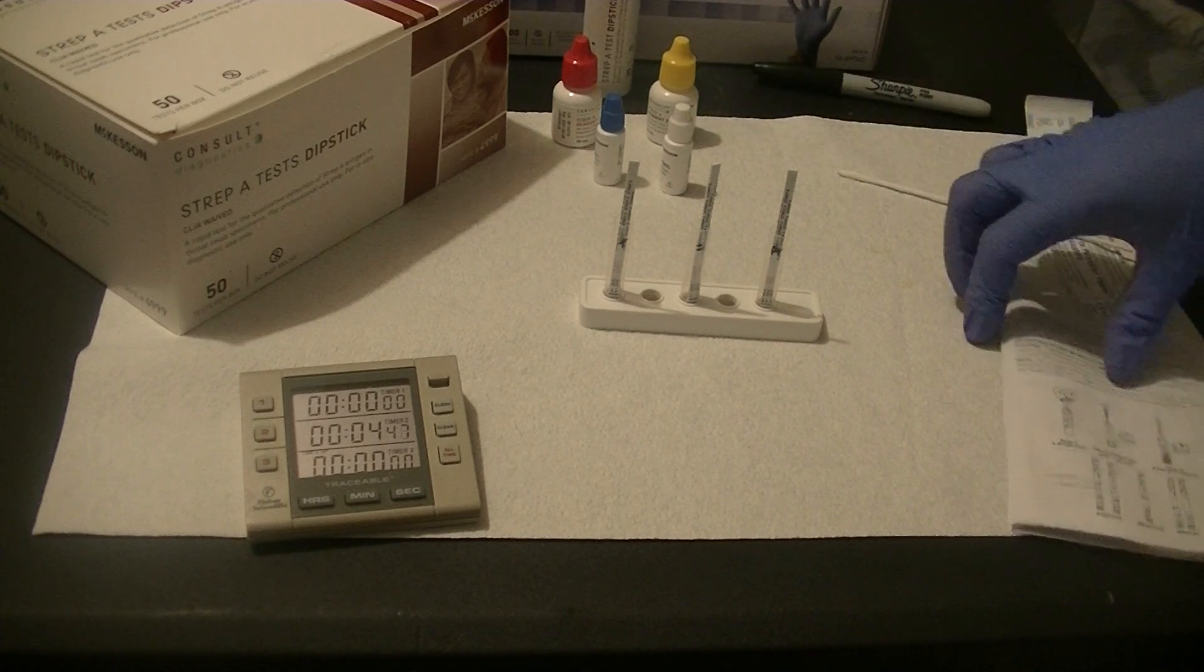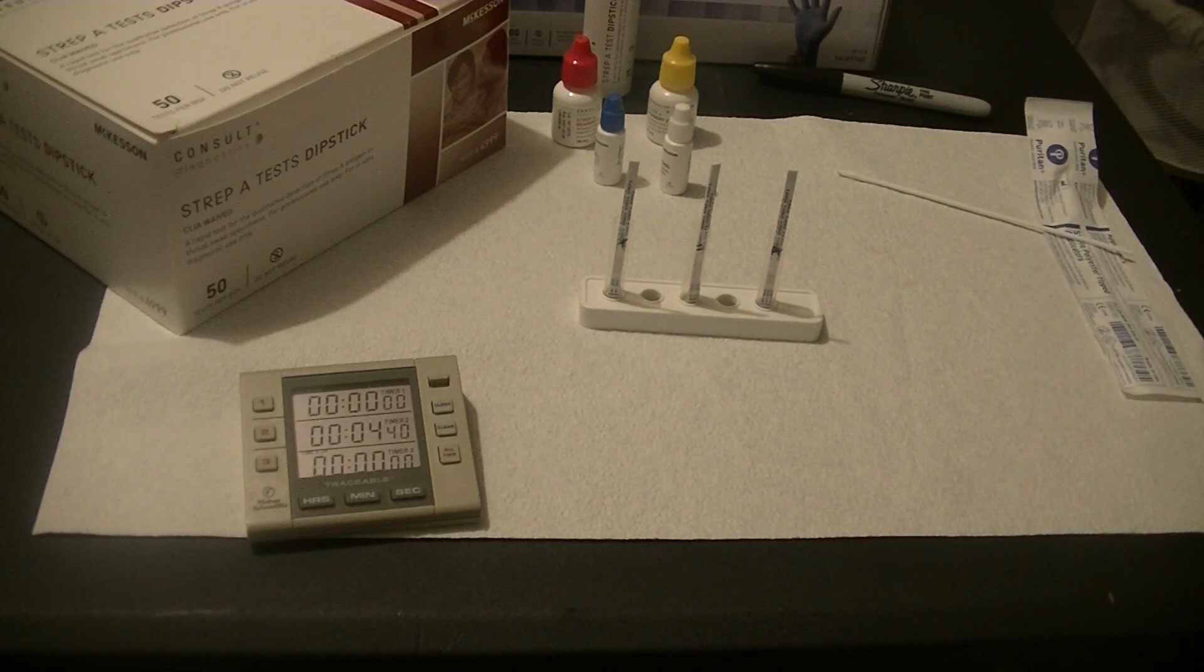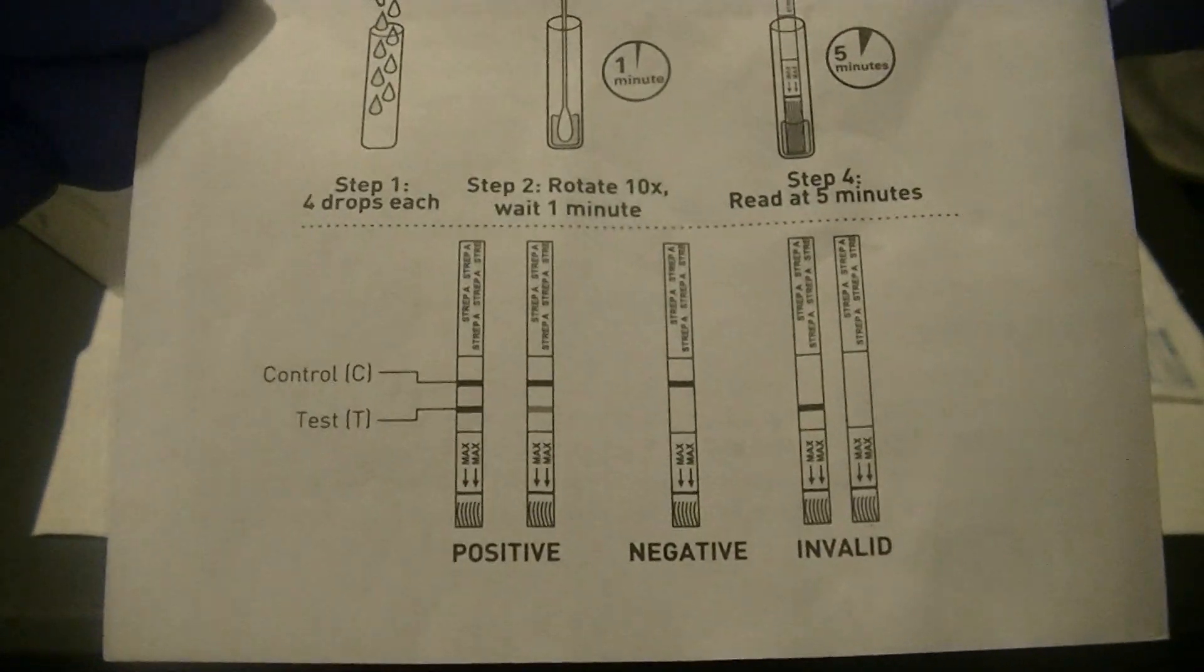We're going to see if we get a control line and a line in the test area. We're going to read it just like a pregnancy test. What I'm going to show you is the results that you're supposed to be seeing for each type of test.